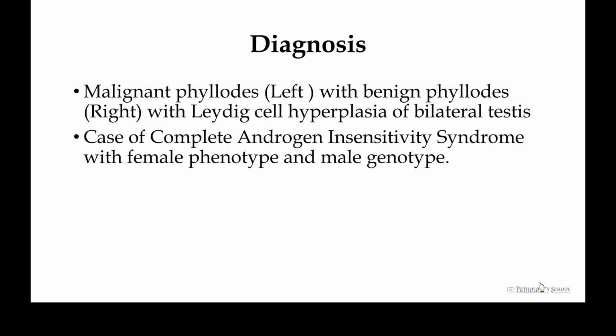Plus, there is no definitive IHC which can differentiate between Leydig cell hyperplasia and Leydig cell tumor, though orchidectomy is the only treatment modality. And there was no abnormal mitosis, no necrosis, no atypical cells noted. Atypical mitosis would be required only for the malignant component, not for a diagnosis of Leydig cell tumor.